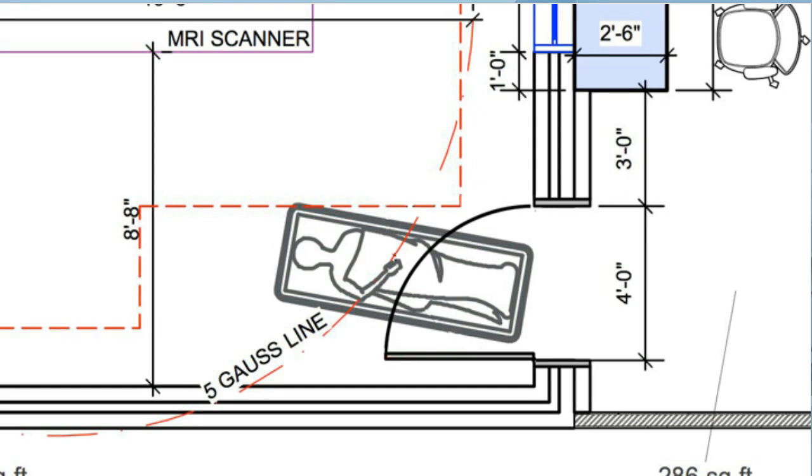I have not yet come across an MRI room door that does not have ferromagnetic components. And then we're going to mount a ferromagnetic detector right next to or on the wall surrounding the door opening. There is the potential that the detector will detect motion of the ferromagnetic components of the door, which doesn't really help us all that much.